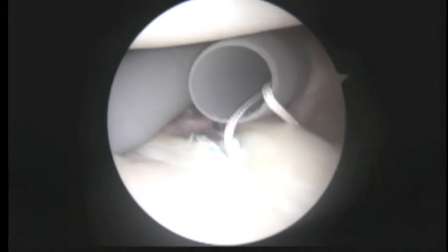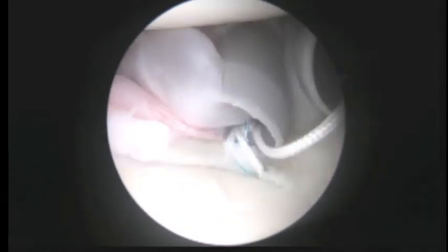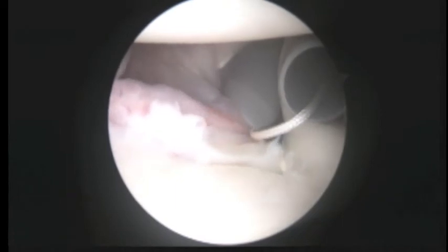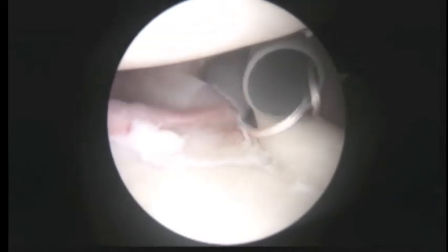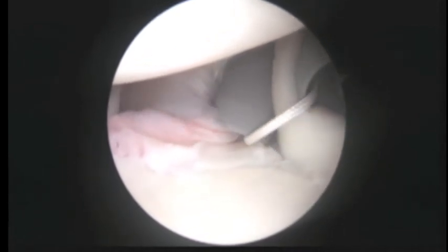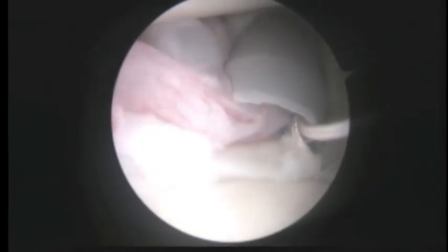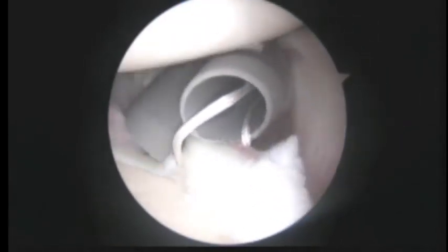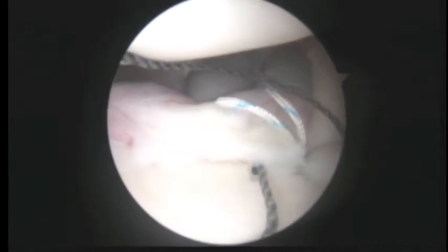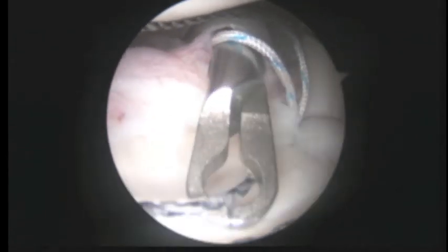Now I'm gonna take out one of the blue and white ones so we're not twisted. Take this out of the way. Pull back on the camera so you can see it front way. We've got those sutures organized, and we're going to tie our first knot right here on the right side of the screen. Here's our second pass with the suture hook. We'll reach in here and grab the relay next.